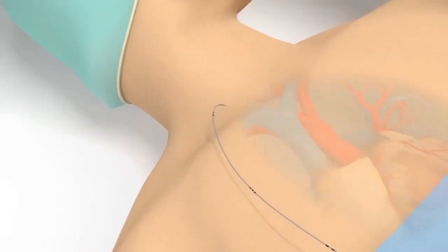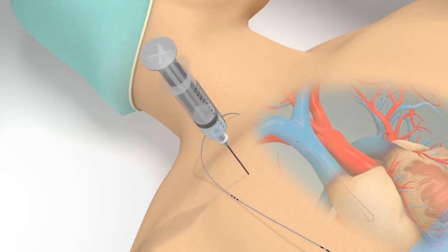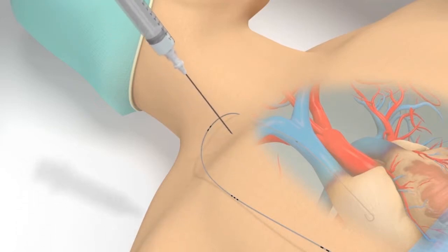Whether using the 18-gauge introducer needle or micropuncture kit method of insertion, you will use the same procedure to create the tunnel tract. Identify the tunnel tract. Mark the exit site. Begin by administering local anesthetic to the tunnel tract and underlying tissue.